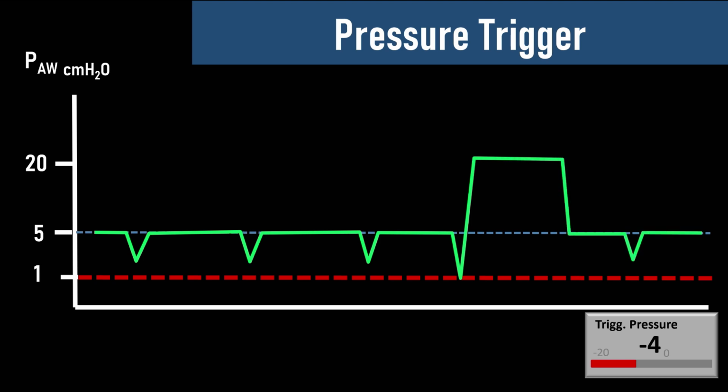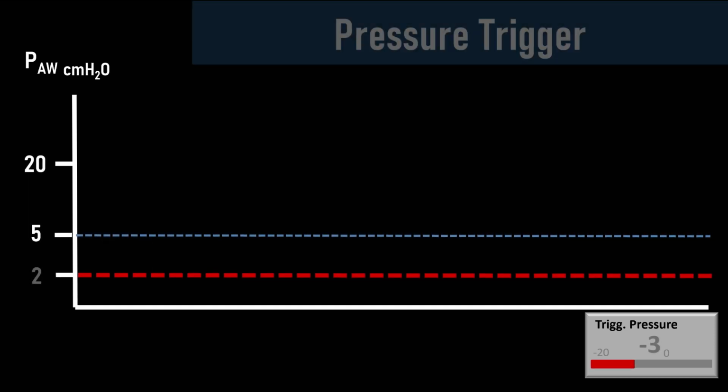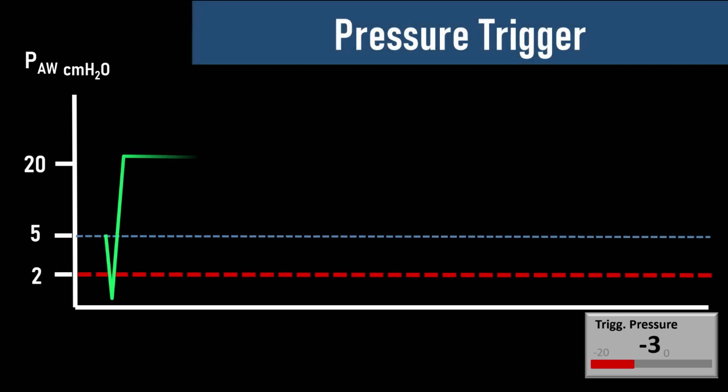Oh, this is clearly terrible. This patient is totally under-triggering because they can't suck in enough negative pressure to activate the ventilator. So let's put it back up to -3 and see what happens.